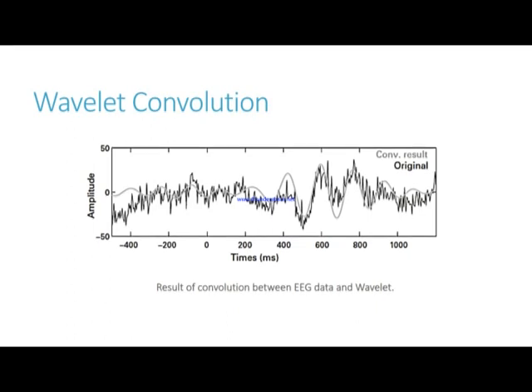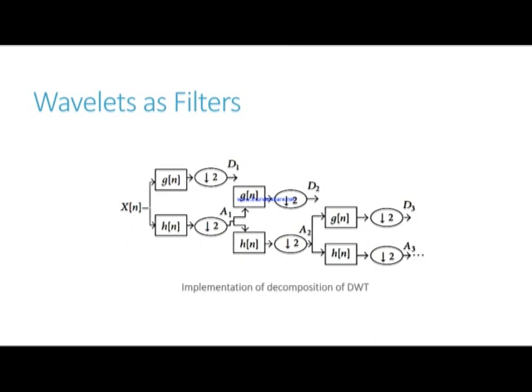Wavelet transform allows the use of variable size windows. In order to get high frequency information, short time windows are used. Let me explain this picture by saying that xn is the raw EEG data, and each step contains two digital filters, Gn and Hn.